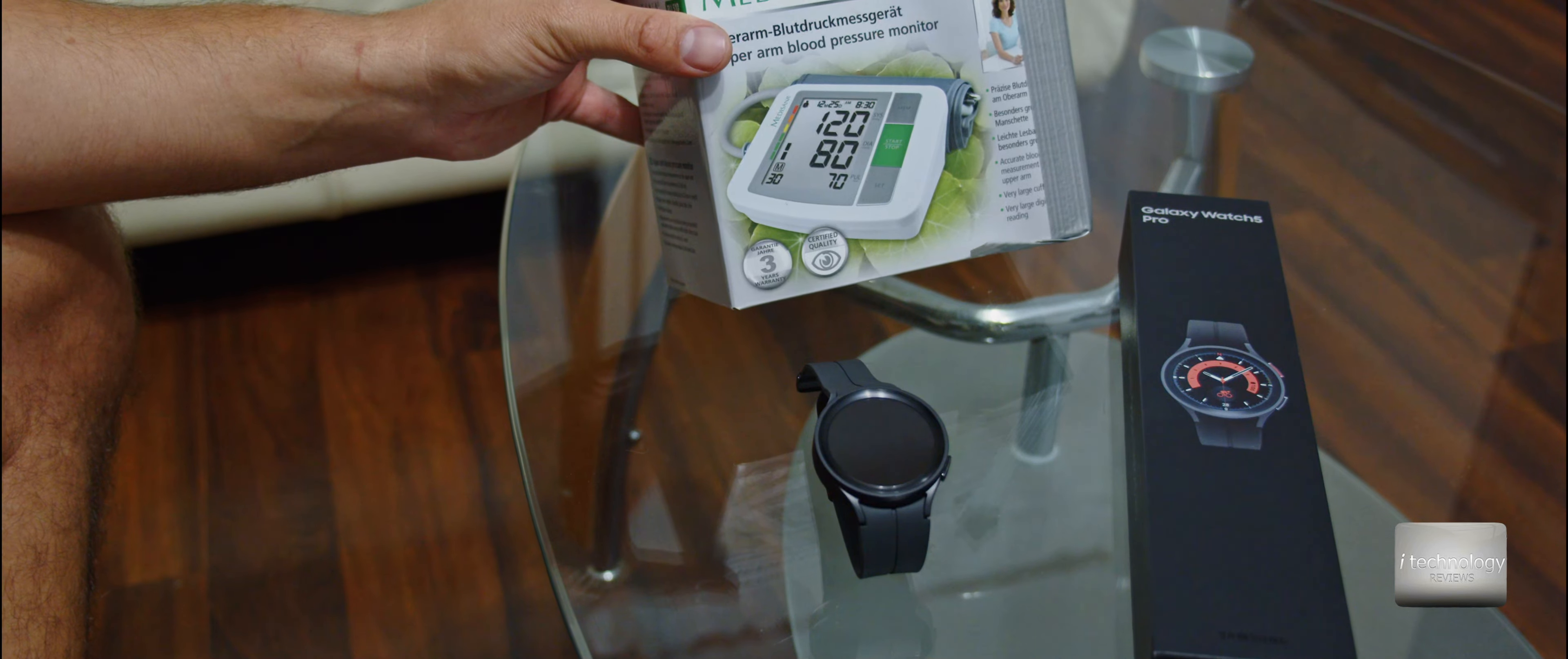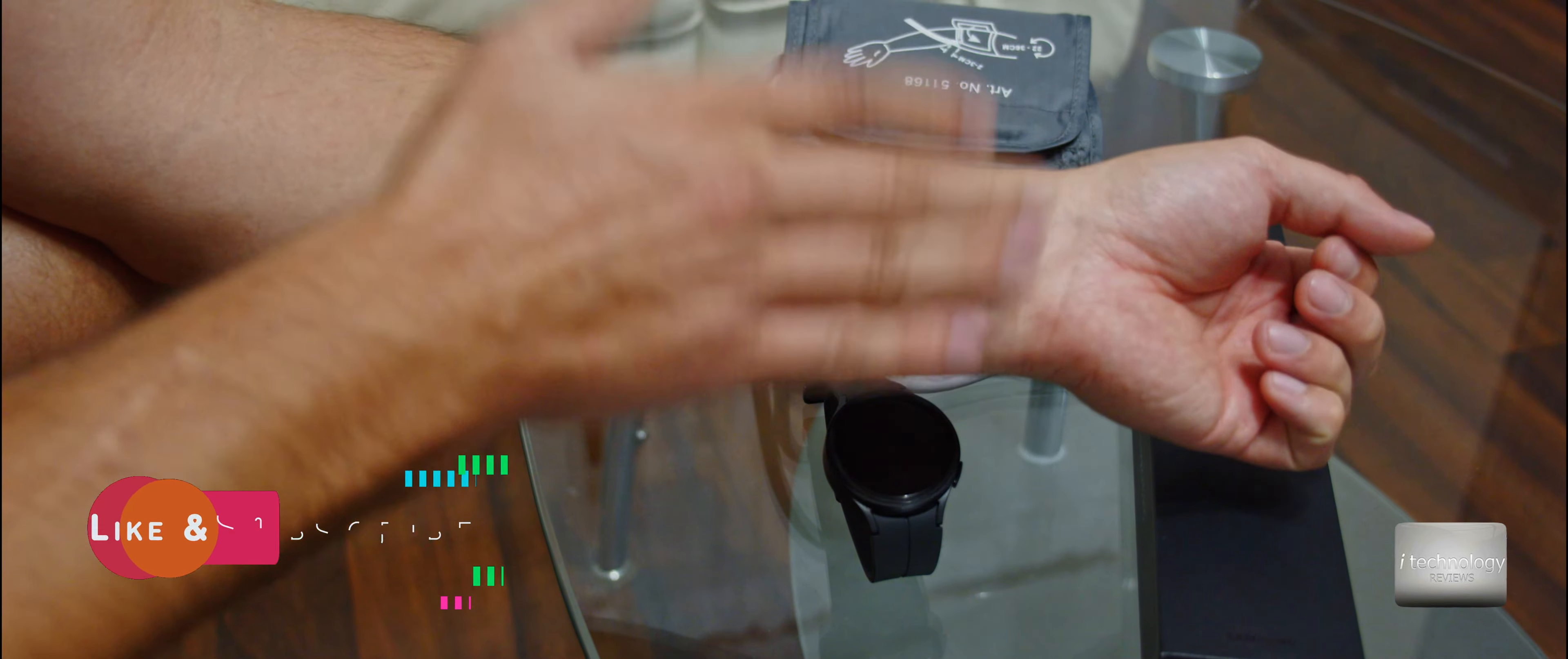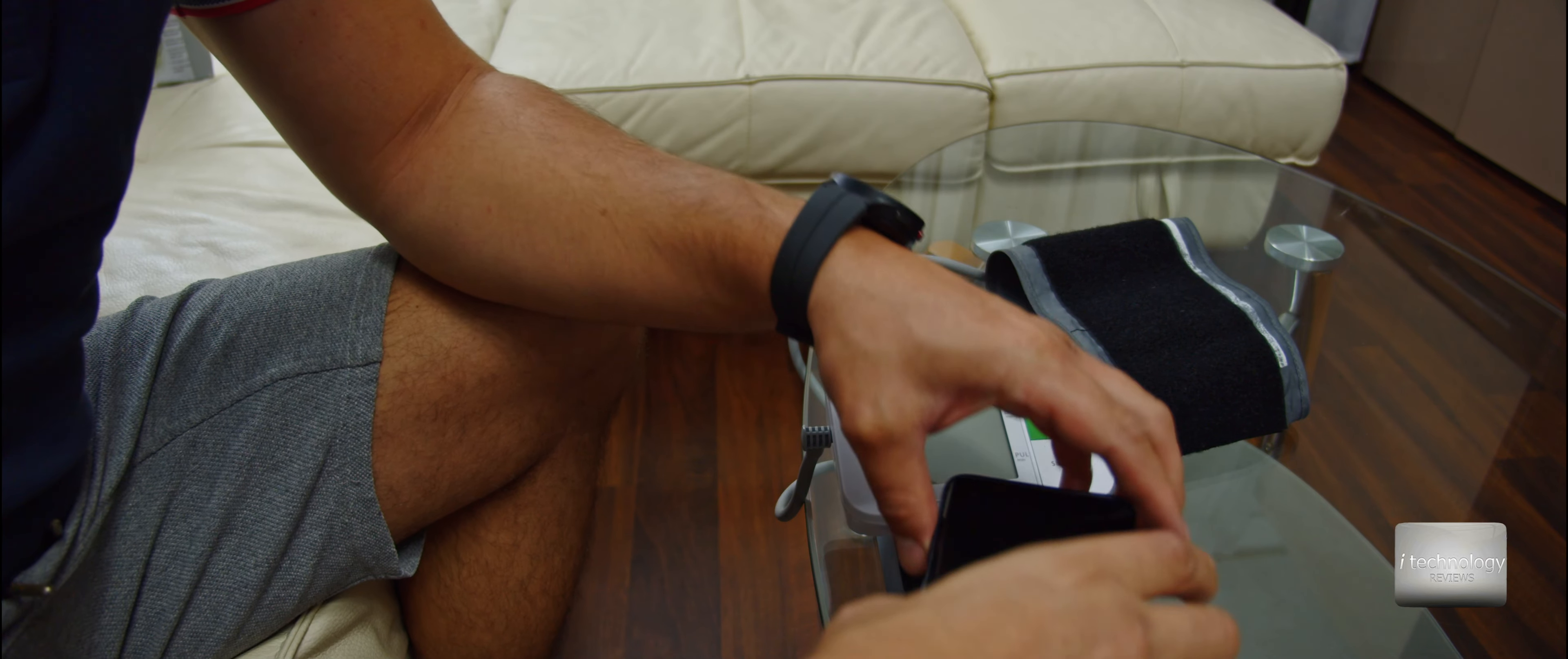This is for the arm. For doing this calibration and test, you need a blood pressure monitoring device just like this one for the arm. You cannot use the small devices for your wrist. Those are not very accurate. These devices for the arm are the most accurate devices on the medical market.